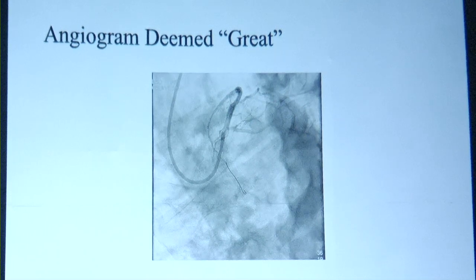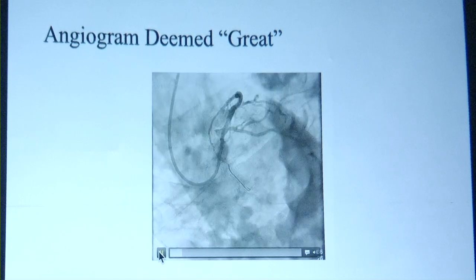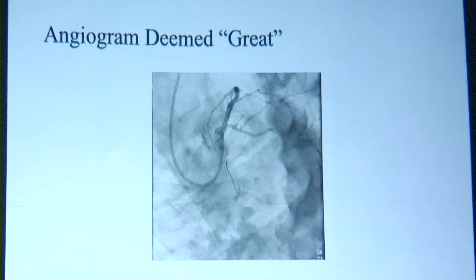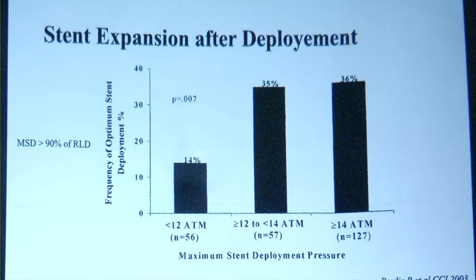The case was done. This is the angiogram that at the end of the case looked very nice. Everybody liked it. We were all happy. But the one thing I would ask you to do is never get done without doing an IVUS, if possible.